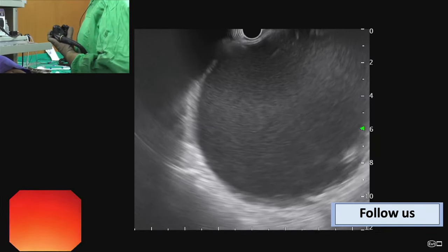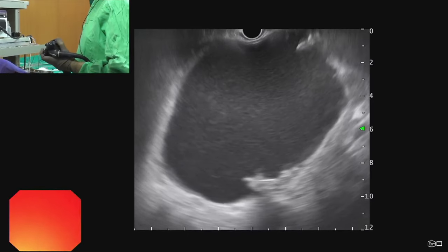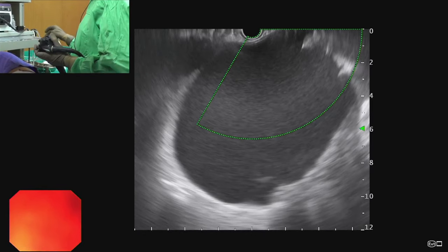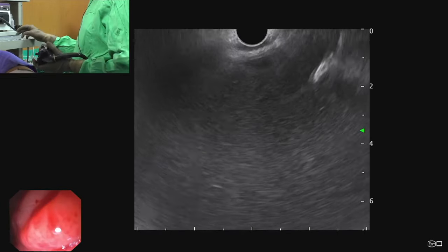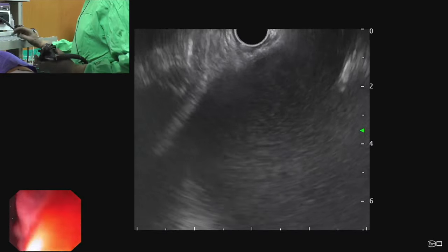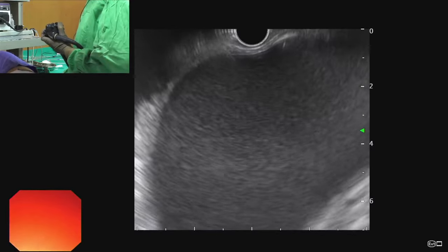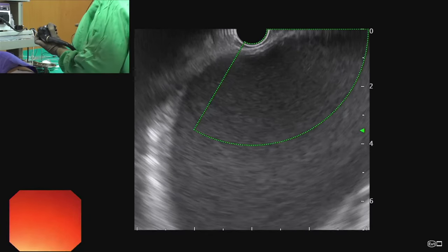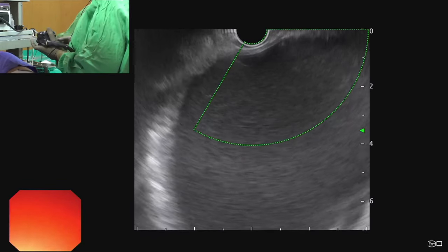When performing ultrasound-guided drainage, most of the procedure is performed under endosonographic vision. If we try to switch to the endoscopic image, we have to get away from the gastric wall and the accessory may loop inside the gastric lumen, causing the wire to come out. In this patient we have chosen the mid-gastric body for stent placement between the stomach and the walled-off pancreatic necrosis. We apply Doppler and confirm there are no vessels.